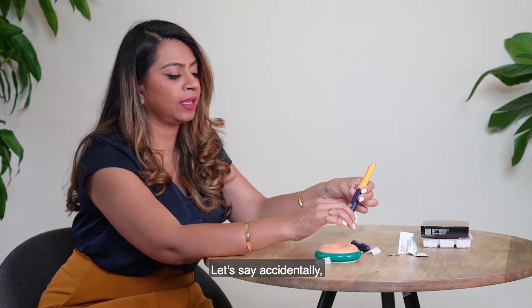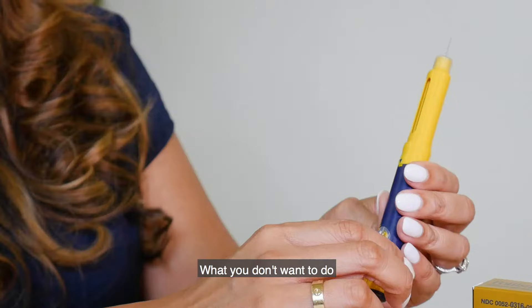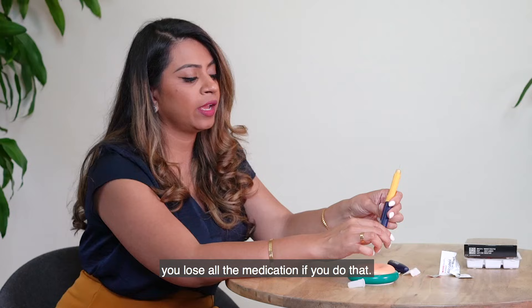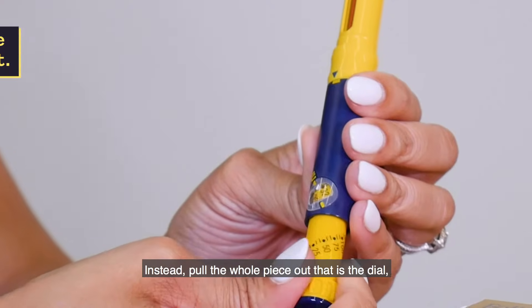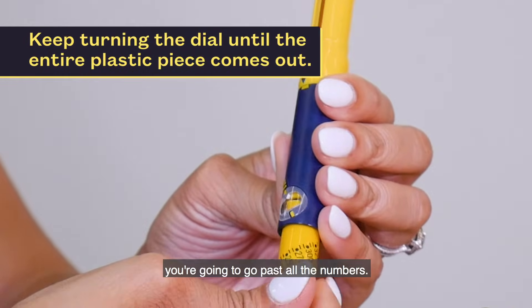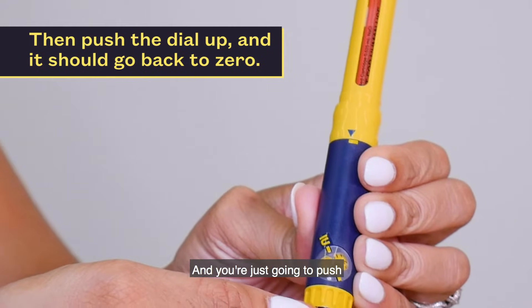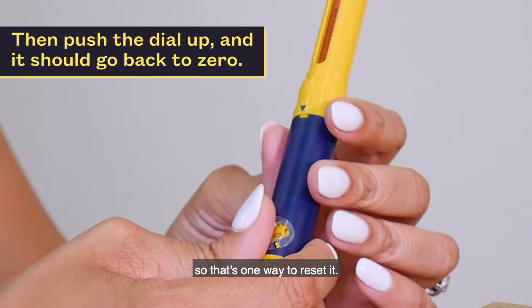If you accidentally overshot and dialed too much, don't try to dial back down because you'll lose all the medication. Instead, pull the whole dial piece out, go past all the numbers until you get a plastic piece in the window, then push — it will go back to zero without losing any medication. That's how you reset the dial.